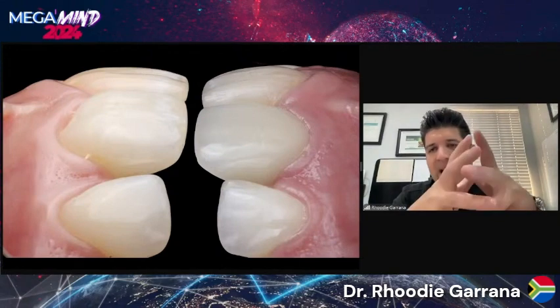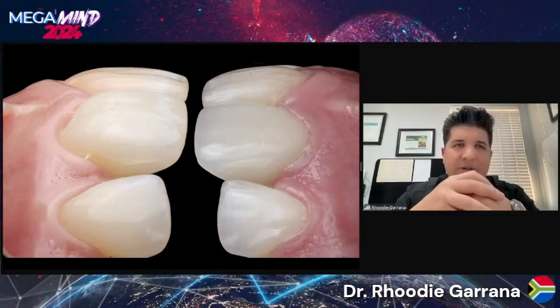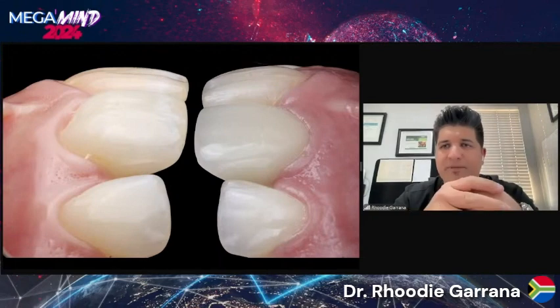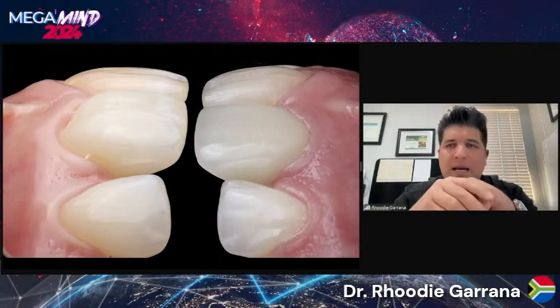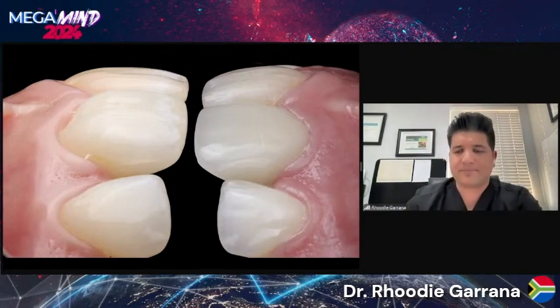And once again, I'm a periodontist. I don't do any final restorations. I send them back to their clinicians for restoration, but these are my provisional. So this is a provisional that the patient kept for 6 months.